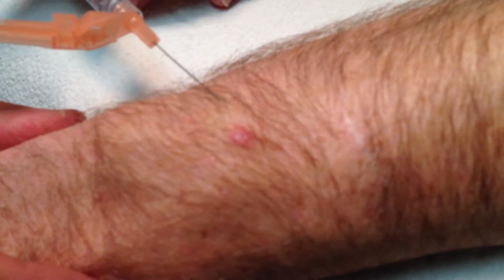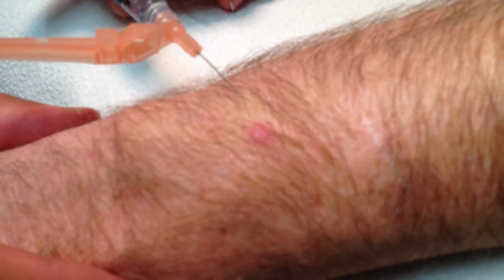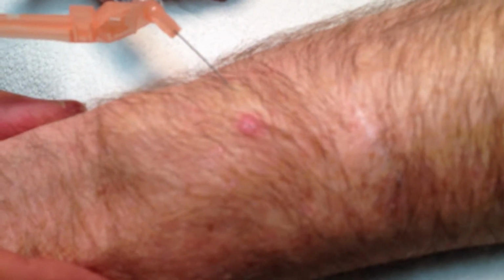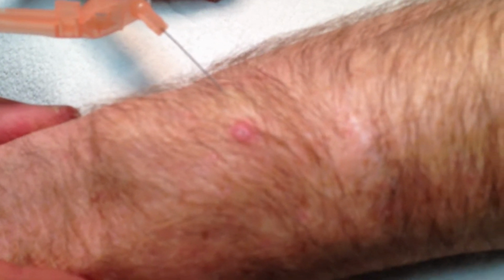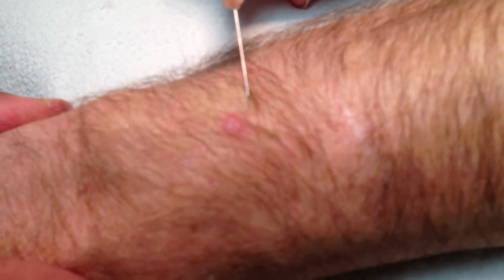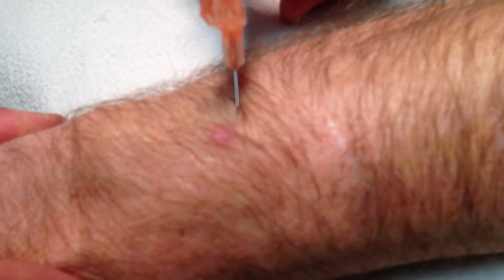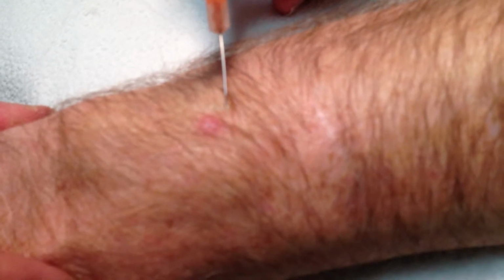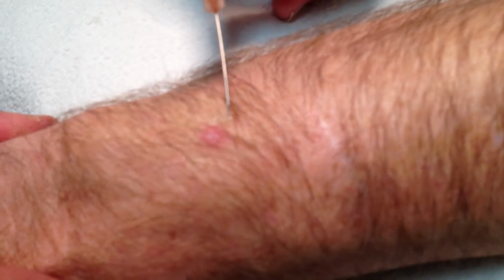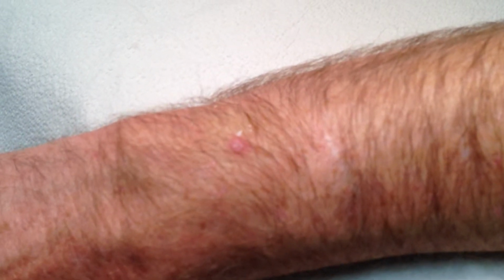And just come out and fan it out the other direction. You want to get a good coverage out to the sides of the lesion. And you come along the side border here. Since that's numb, that shouldn't be feelable by now. And then he'll feel another burn as I inject the far end of the apex. And that's 3 cc's, and I'm going to go grab another 2 cc's of lidocaine.